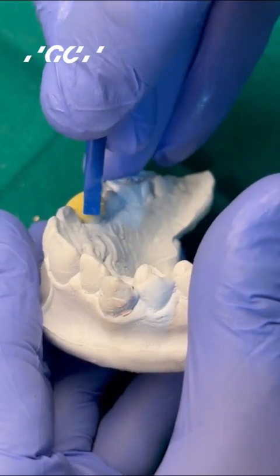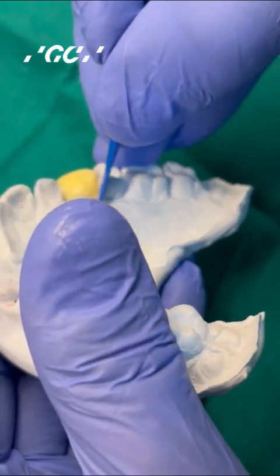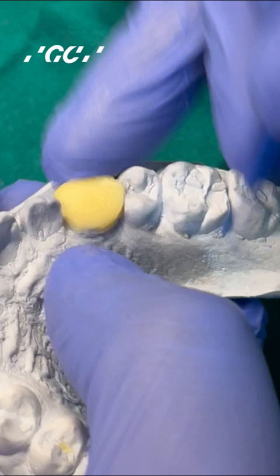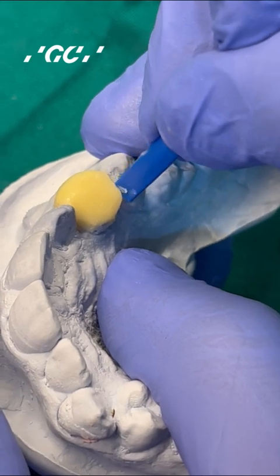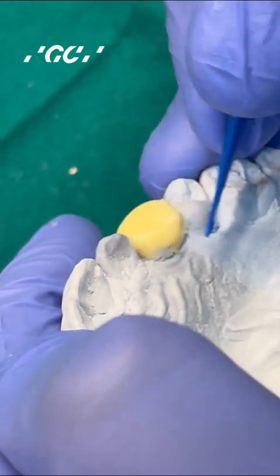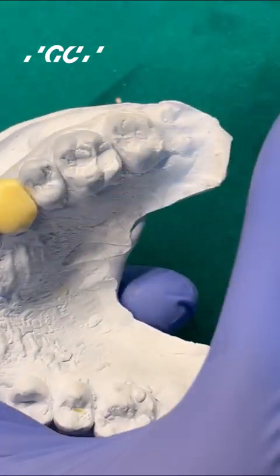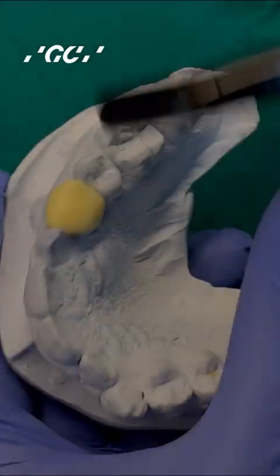In this particular case, there is no opposing tooth, so we are just going to get the anatomy of the crown that we are making. Make sure you don't go too much into the undercuts, otherwise it will be a little difficult to retrieve the temporary. Once you have got the approximate anatomy, you tack cure it — especially the margins, because that is where you are going to pull the crown out from.